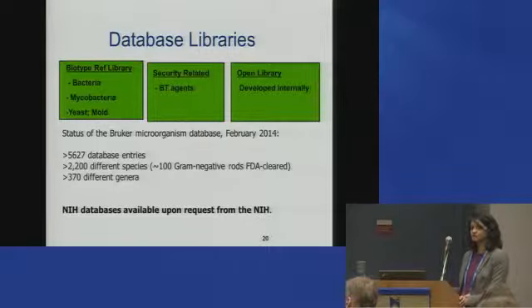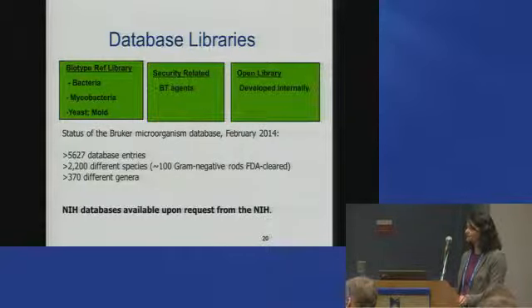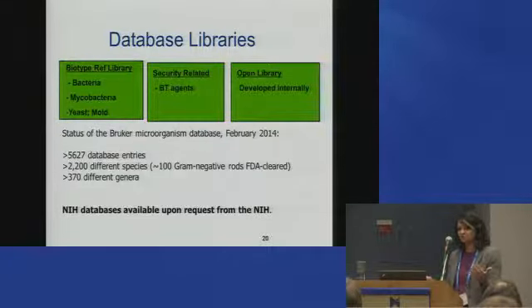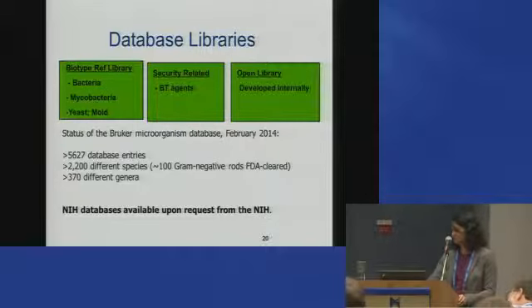Now, another great resource is the NIH database, which is available upon request from the NIH, because the NIH has been working on the Bruker MALDI system for a few years, and they have developed their own databases for how to identify organisms, especially the molds, for example, and mycobacteria, nocardia, okay? So it's really kind of cool to have that ability to ask NIH to give you access to those libraries, and then that way you can query their library as well along with your own library. Okay, so it's taxpayers' money being put to really good use here.